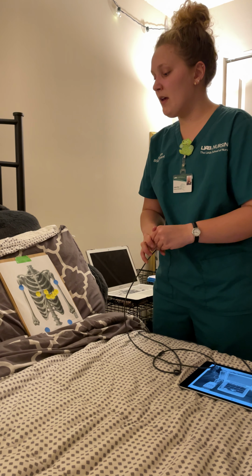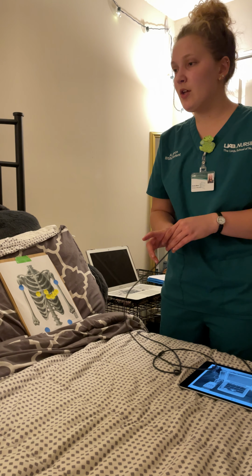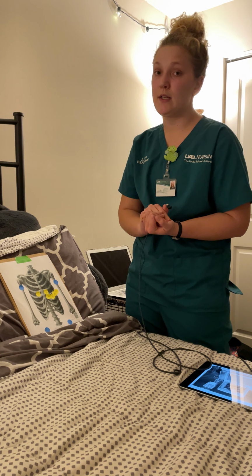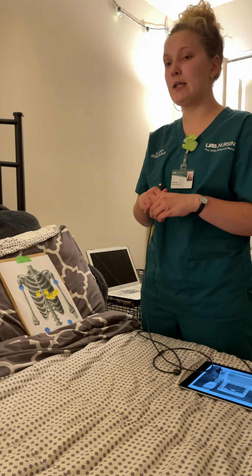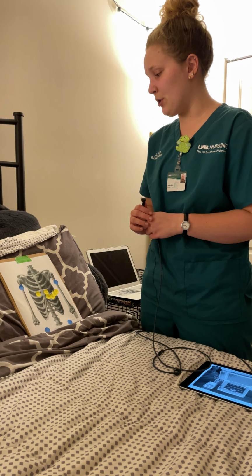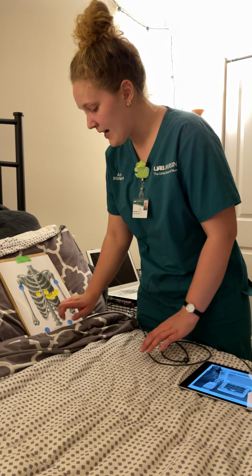And when I'm placing all of the stickers, I make sure to check the skin around them, that the skin is dry, that there's no redness or erythema noted, that if there's any hair, I would be sure to shave it. If there's any lotion or oils or anything like that, I would be sure to clean it prior to putting the stickers on the EKG. So all of my wires are now attached.